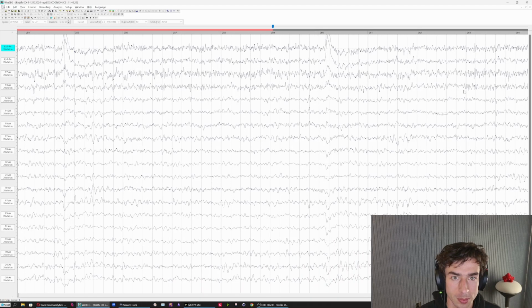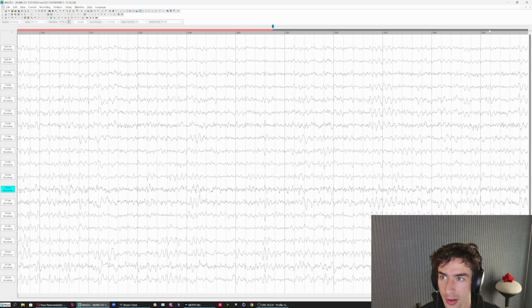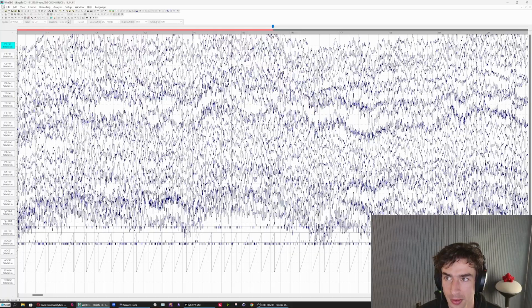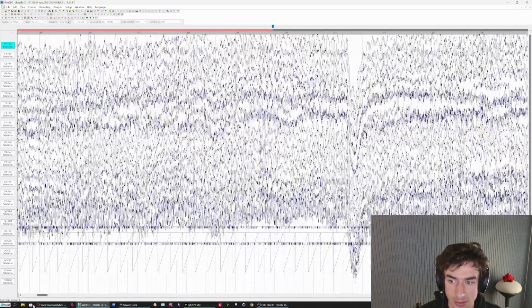Okay, so I'm satisfied with the amount of eyes open data that we have. And I'm going to close out of these. We'll save this one that's been artifacted. And now we're on to the eyes closed. And this looks like the longer of the 2 files.